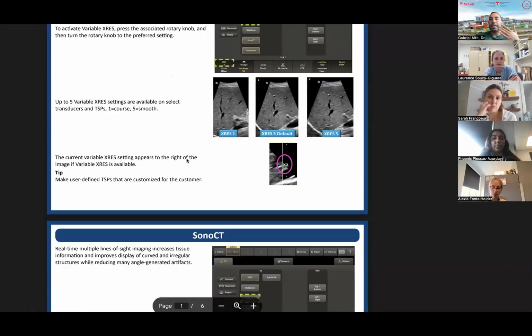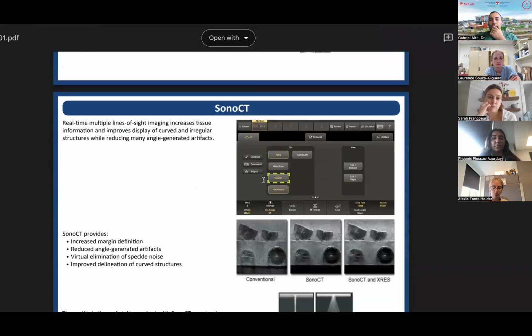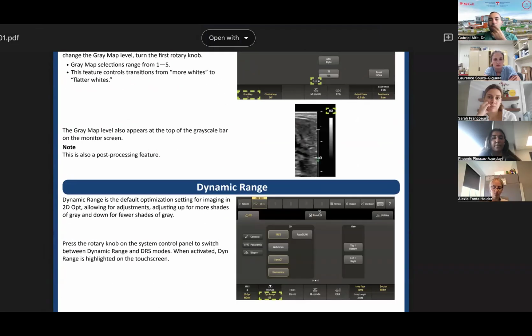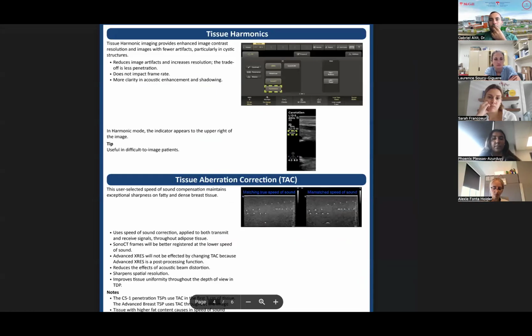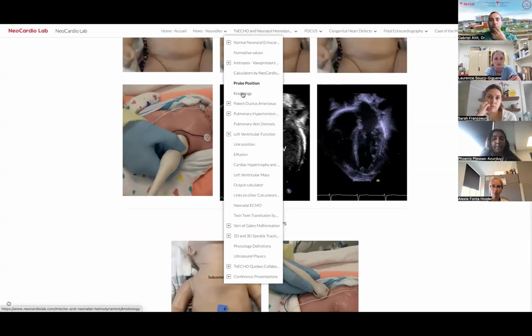depending on the image you're getting. And often how you'll do that is that you will be using, where's my wheel? No. Let's go back to knobology.